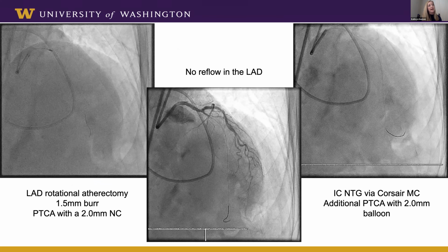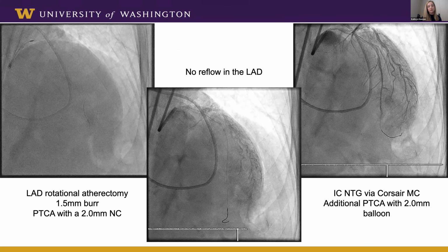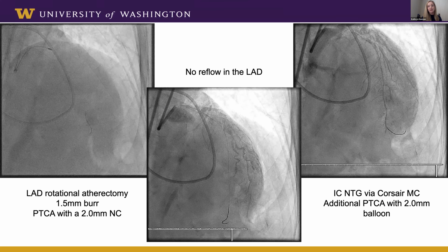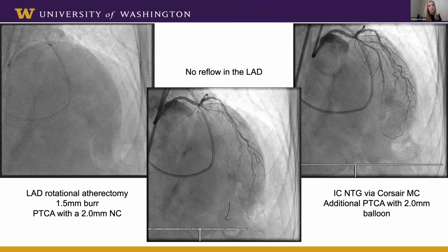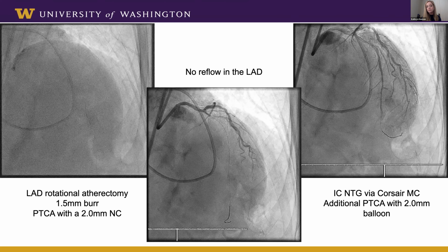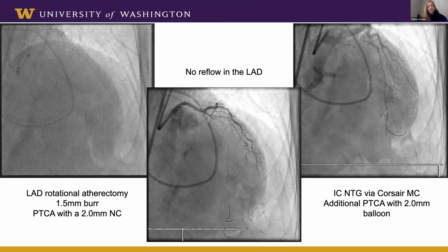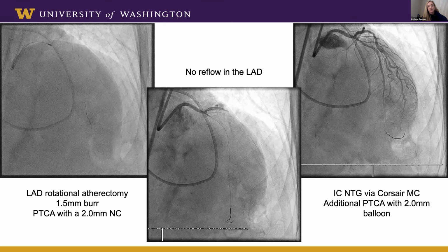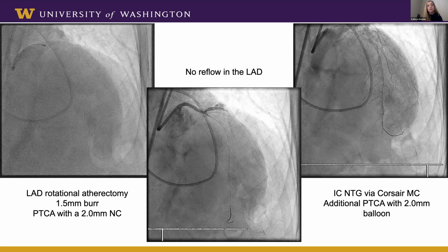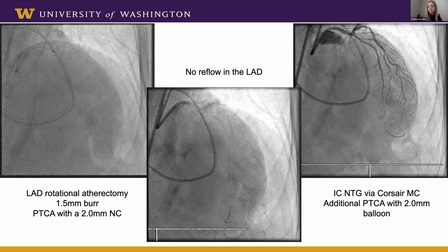The one complication this gentleman had was that around this time, our pharmacy, which had previously been putting nitroglycerin into the Rotaglide empirically, put the kibosh on that and said we couldn't do that anymore. So right after rotational atherectomy into the LAD, he started having chest pain, ST segment changes, and some no-reflow into the LAD. Fortunately, we treated that with initial balloon angioplasty with a 2.0 balloon, and then inserted a Corsair microcatheter to give intracoronary vasodilators into the LAD. We gave some nitroglycerin, and that resolved his no-reflow. Fortunately, he remained stable through this.